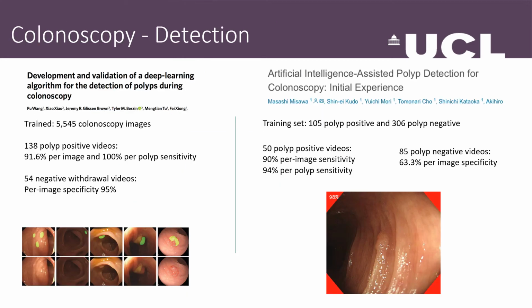We've seen this development being worked on in early papers, and we've seen a lot of the work coming out of Japan and China with this. And you can see that we've got sensitivities of 90, 100% in some papers, but we're looking at good early data for us to build on.